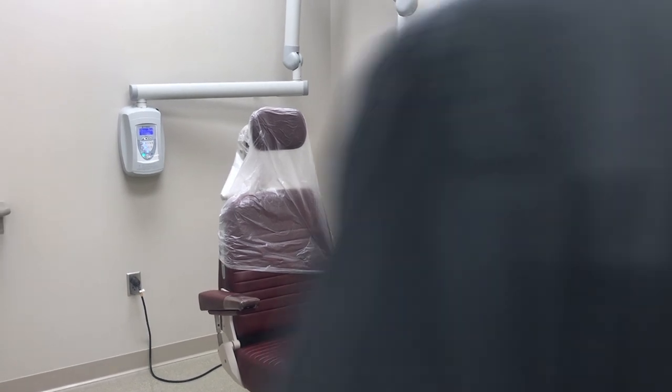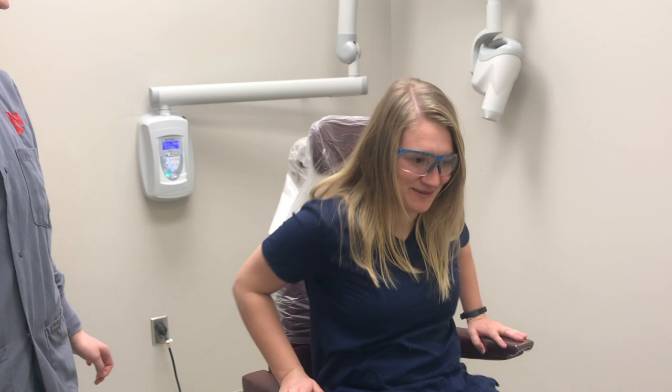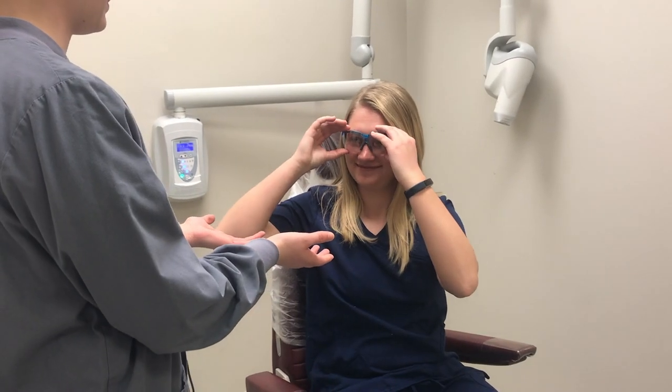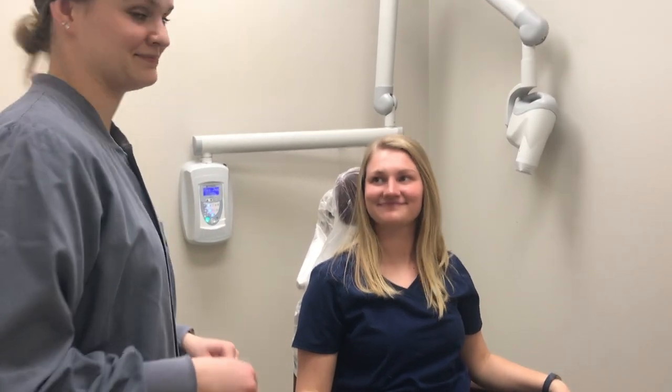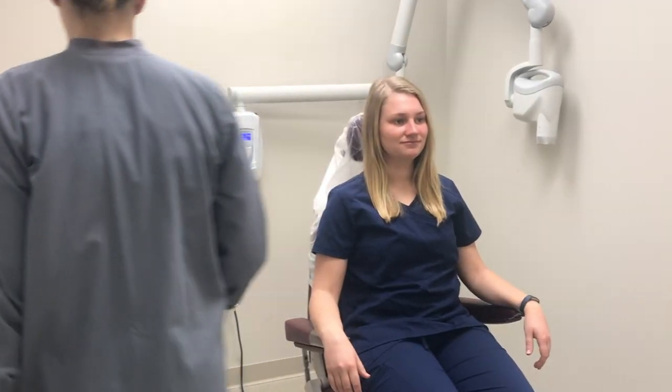Clear all obstacles out of the way for the patient. Remove patient's glasses and any intraoral devices, such as partial dentures, dentures, and/or lip or tongue piercings. Place a thyroid collar on the patient.